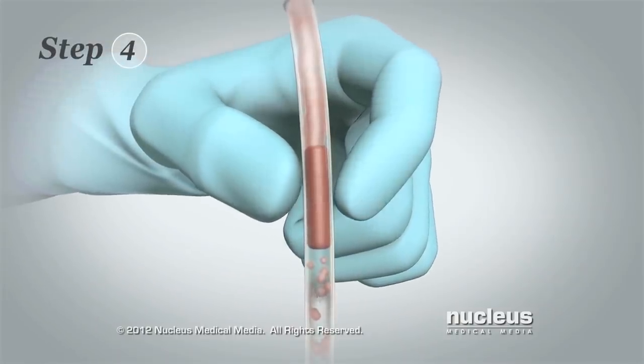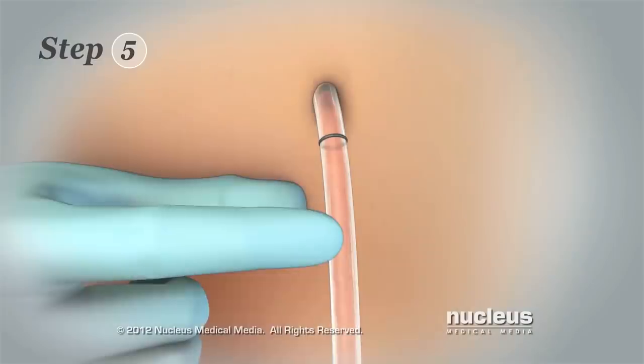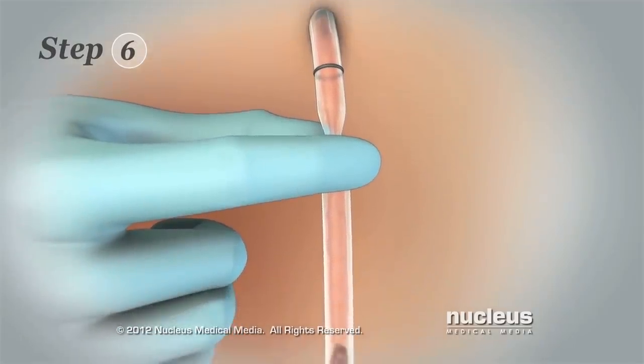Step 4: Loosen the clots by gently squeezing the tube surrounding them. Step 5: Use one hand to hold the drain tube in place where it leaves your skin.